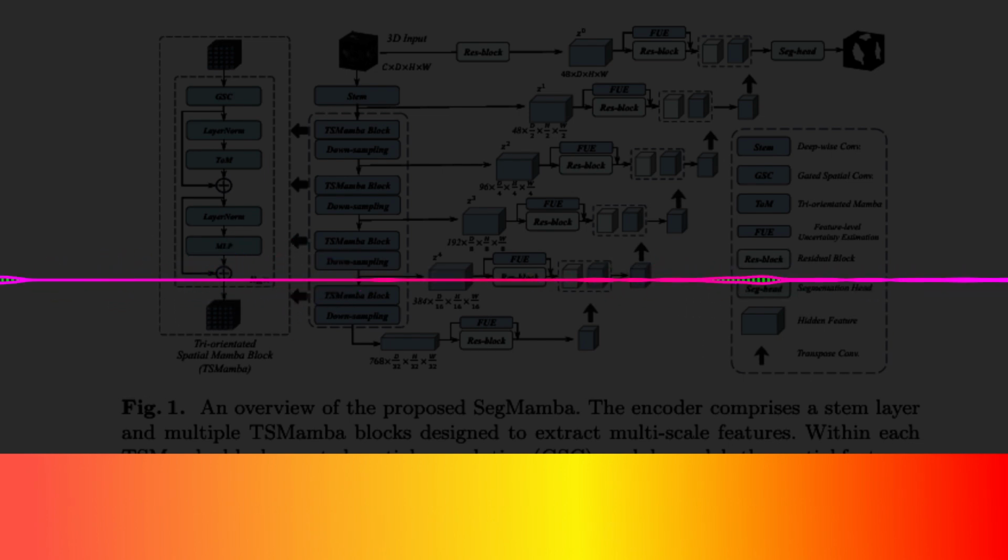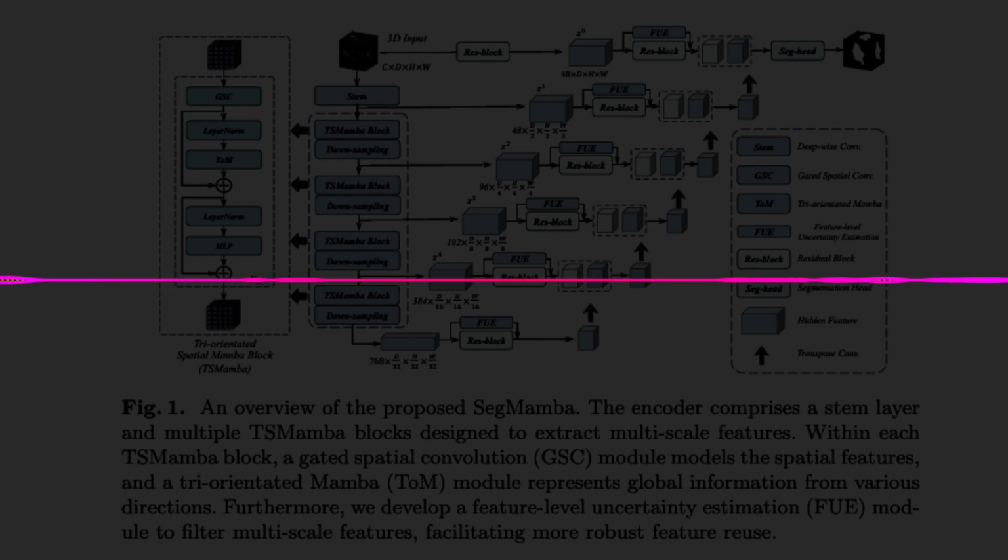Similar story there. Highest IOU, another overlap metric, and also the best scores for things like detected length ratio and detected branch ratio. Those specific metrics suggest it was better at capturing the thin, continuous branching structure of the airways without breaks. Which is tricky, I imagine. Very tricky, yeah. Easy to lose the smaller branches.